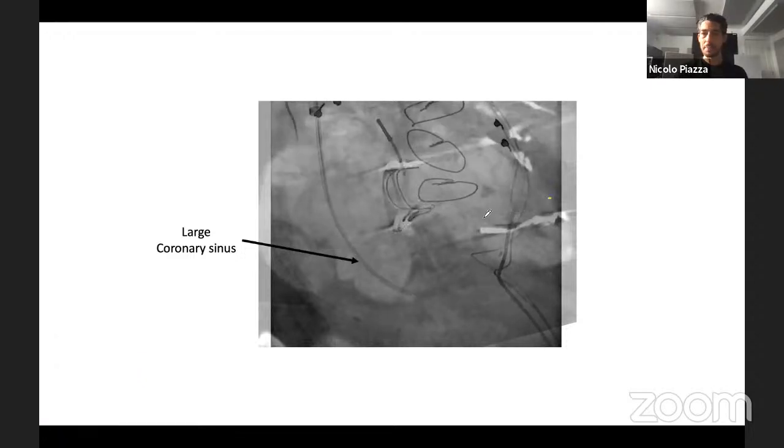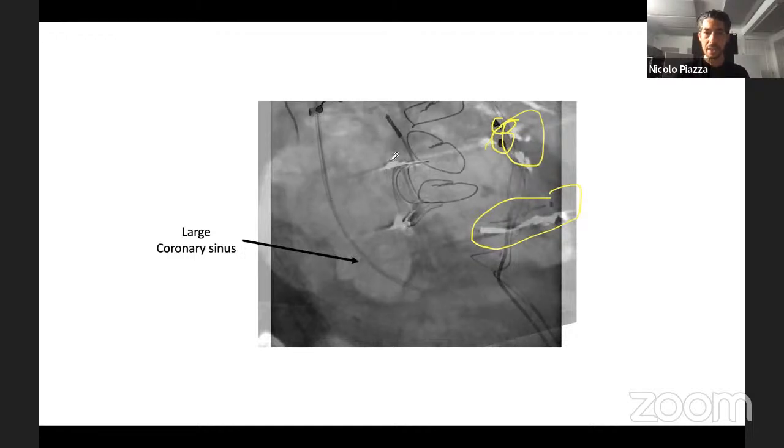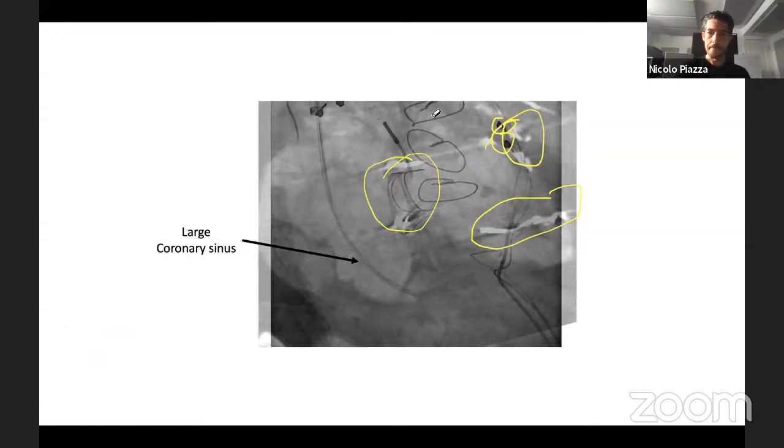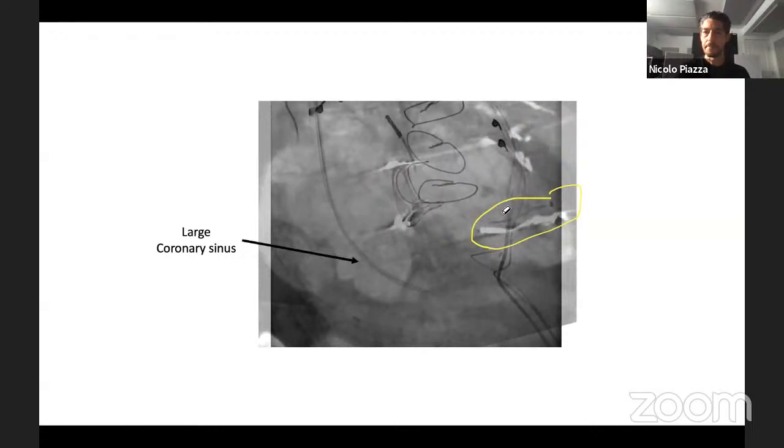Look at this pacemaker lead here with that artifact behind it on the CT scan. Notice these two things here are reflections of this. And here's your bioprosthesis overlapped with your... let me just erase this here.